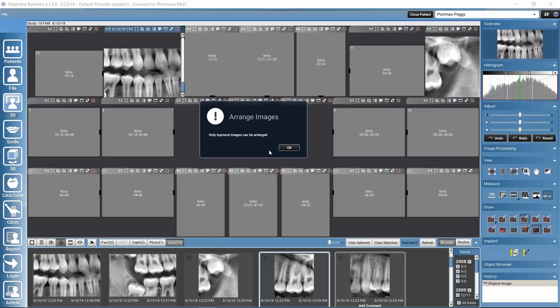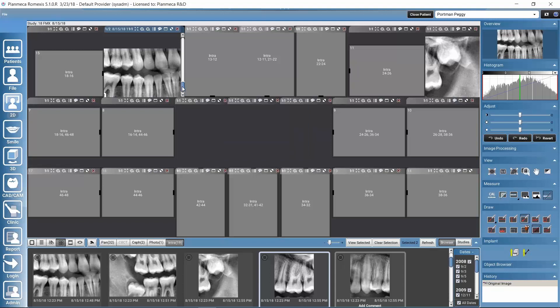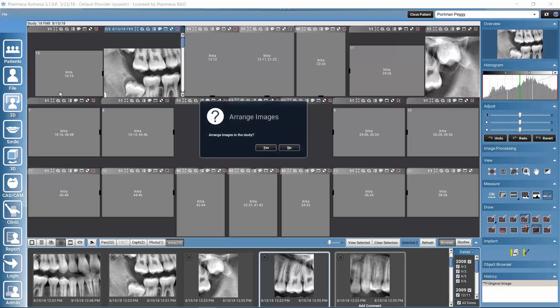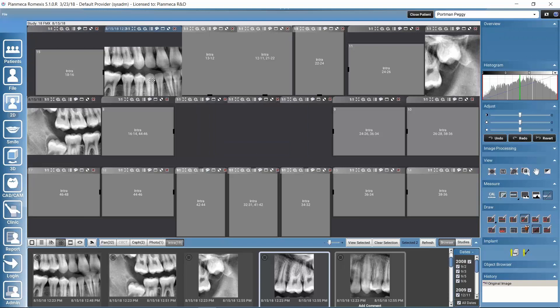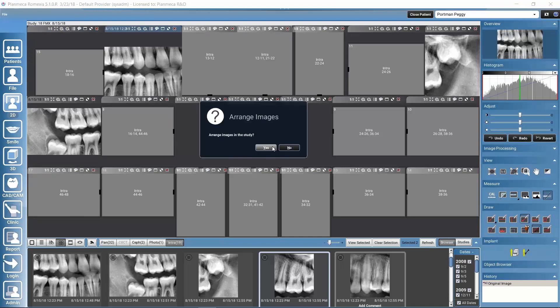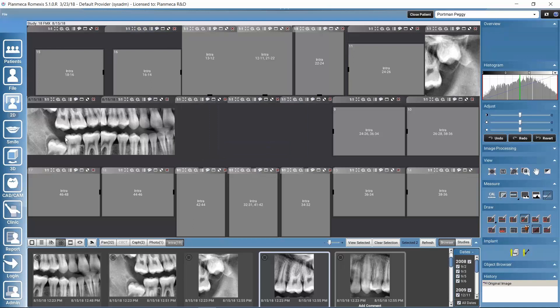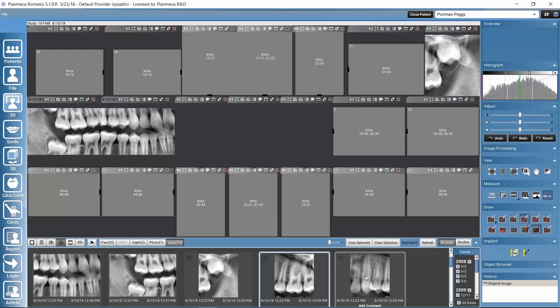Another option when dragging to an occupied slot is 'Move', which stacks images on top of each other in the same slot. This creates a small slider to browse all images stacked in that slot. Note that we can only move the topmost image. This covers adding images, removing them from the study template, and moving images between different slots.